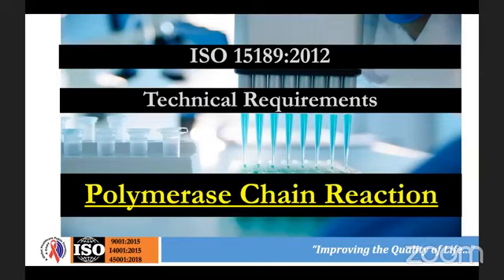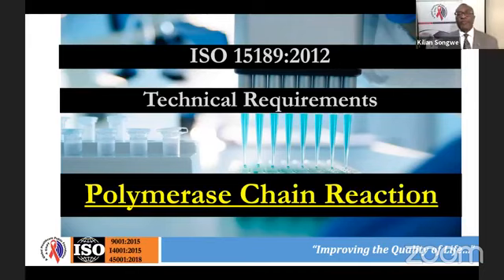But also, the manufacturers like what they call equipment placement. If you have a facility that is already running and you're looking at setting up some of the platforms, some of the equipment manufacturers will be very happy to give you the equipment and you only have to procure supplies. So that's the easiest, based on what we have seen. And if you already have the basic infrastructure, that would be much easier. Thank you, Kilian.